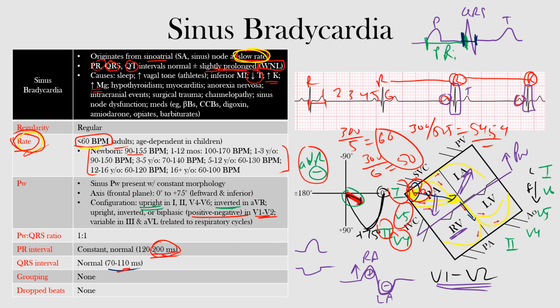Well, that's the end of this lecture. We discussed sinus bradycardia and how it would normally appear on the EKG. I hope you learned something.